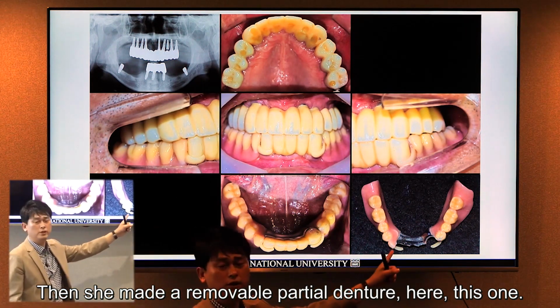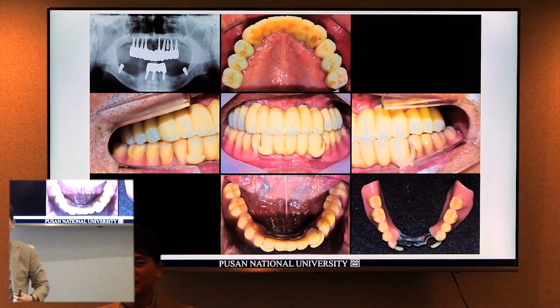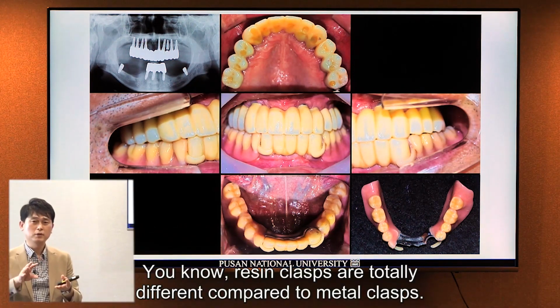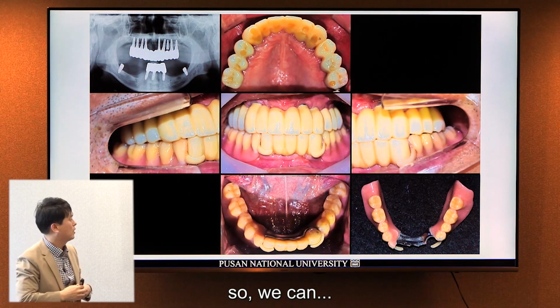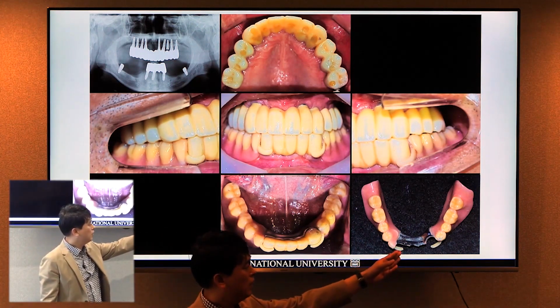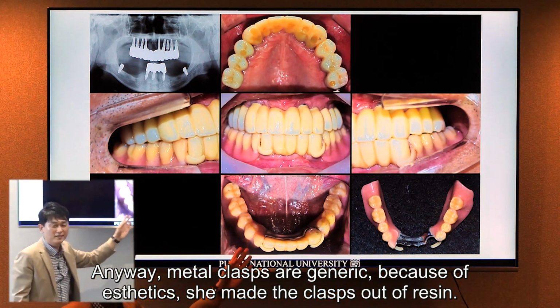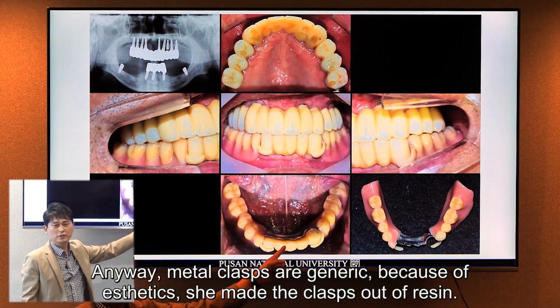And then she made a removable partial denture here like this. Especially, this denture has a resin clasp. You know, a resin clasp is totally different from a metal clasp. Metal is a ductile material. Anyway, the metal clasp is the general choice, but because of aesthetics, she made the resin clasp here.